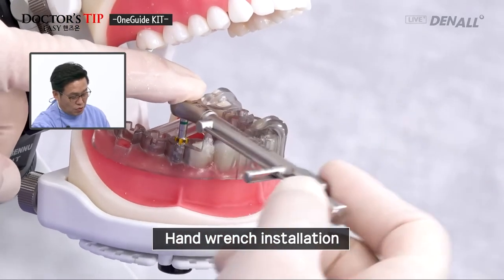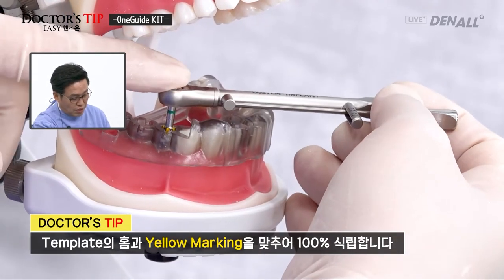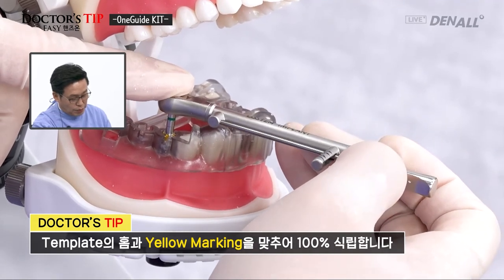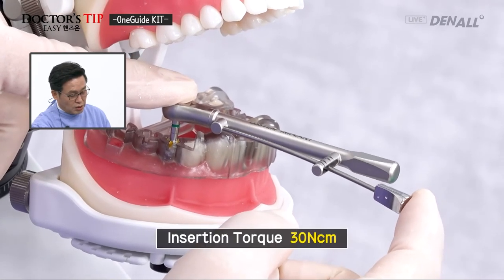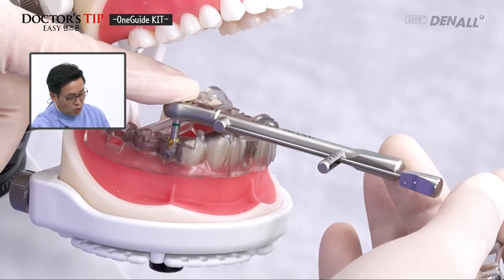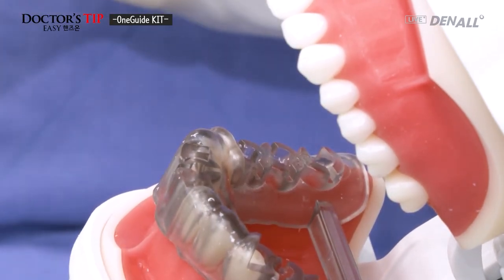And using this, we're going to find the position. Along with depth control, the hole of the OneGuide and the driver's yellow marking need to be aligned. Then you can get the depth and hex positioning that was initially planned. You can see the insertion torque is over 30 Newton centimeters. And this area, this is the point that we want to be in. And we can see that the fixture has been placed in the intended position.